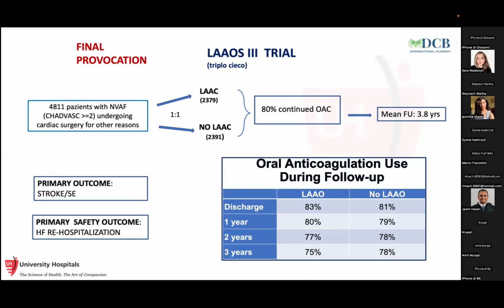Marco, sorry to interrupt. I still have the doubt that, at least in my case history, the vast majority of these patients are really at high bleeding risk. So it's not the typical US patient where he or she can decide to drop the anticoagulant and have the LAA occluded. In Europe, at least, the vast majority of patients have really high bleeding risk.